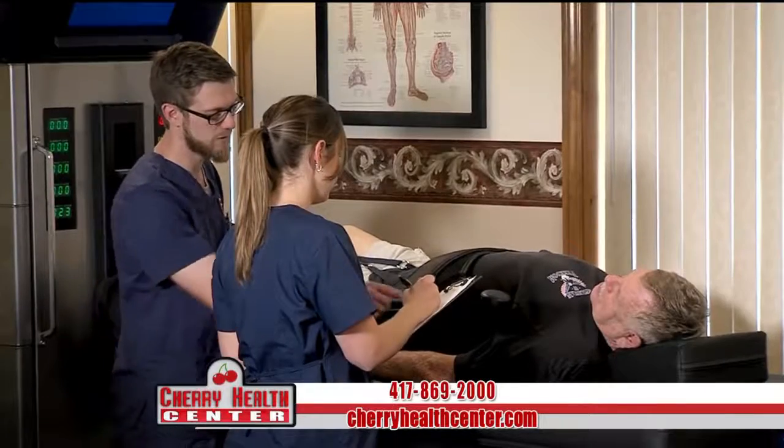People that have plantar fasciitis where the fascia on their foot has calcified or doesn't stretch — we can take this device, apply it, and actually create microtrauma, stretching this tissue and taking away calcium deposits. It's a very effective way to free up a joint using physical medicine, chiropractic, and physical therapy, and you can help restore that function as you break up those adhesions.